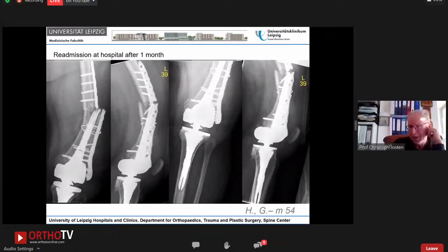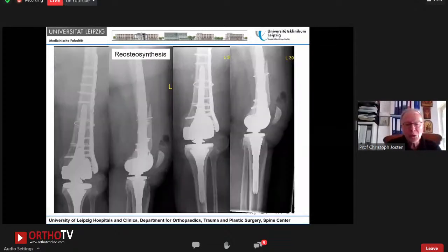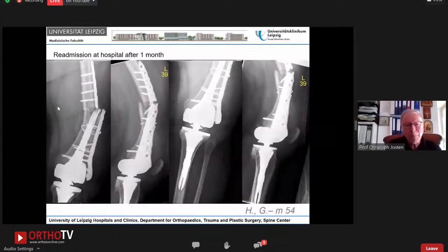Yes, this is a readmission. One month later. So the problem here was not the problem. You see, this was quite rigid. But here we have a stress shielding on the stem. I don't know how to avoid it. I believed perhaps this screw is too near to the tip of the stem of the arthroplasty. Maybe this was my analysis because the fracture has just occurred there. But the analysis looking back is not looking forward.